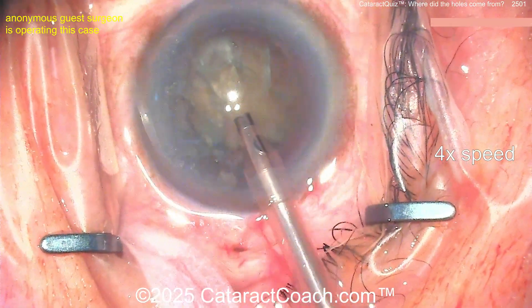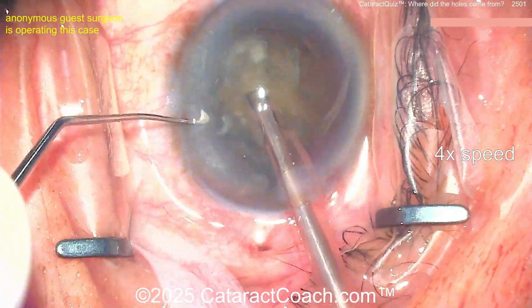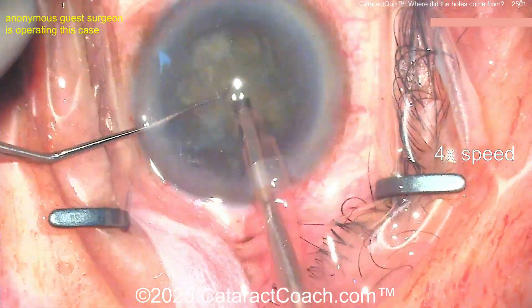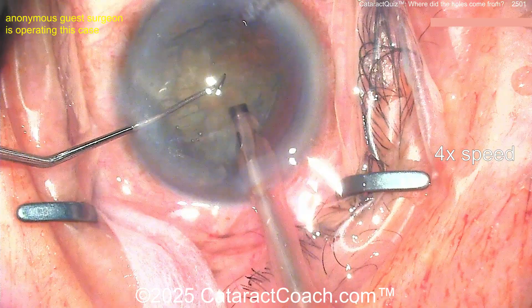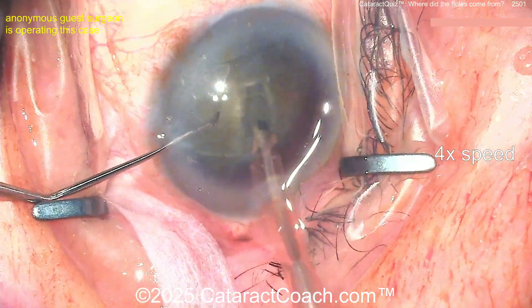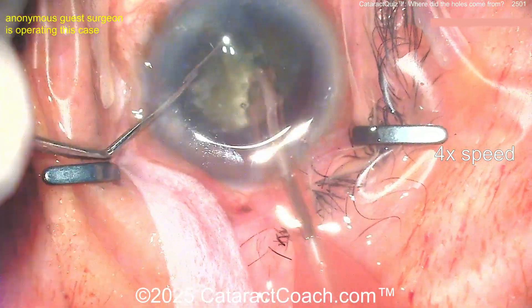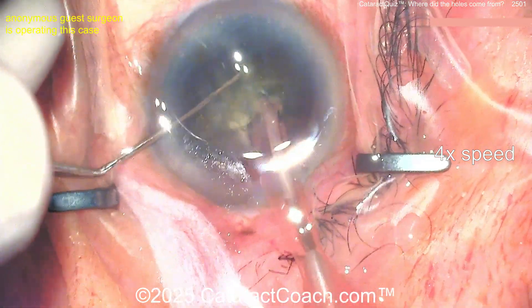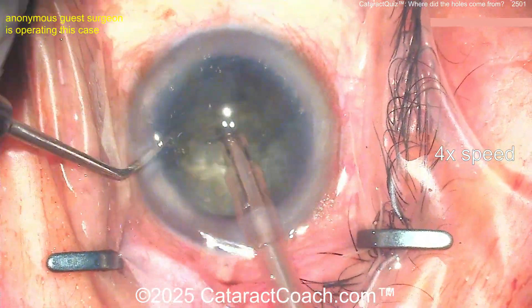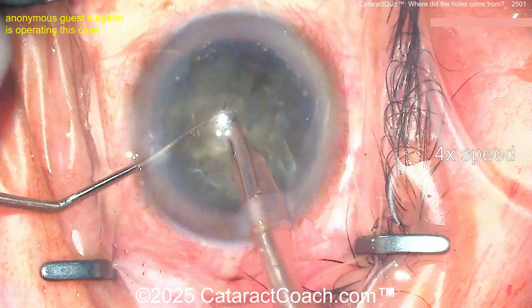Now here's the case: nucleus removal. We sped up the video to get through it in a timely manner. Nucleus removal looks pretty good — this is at 4x speed. Cleaning this up, chop chop chop. There's a little groove, a little pit down the middle — looks like a groove for a chop. There's the chop — maybe a horizontal chop. Split that nucleus, get the crack propagated through. Pretty dense cataract here; the surgeon spends about five minutes on nucleus removal, sped up to about a minute.